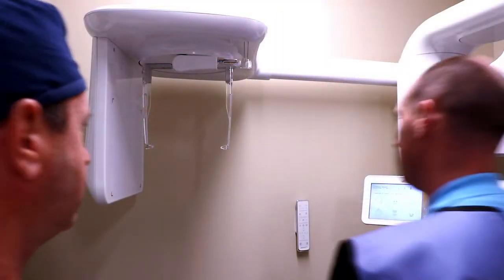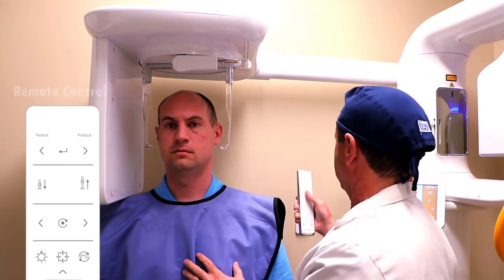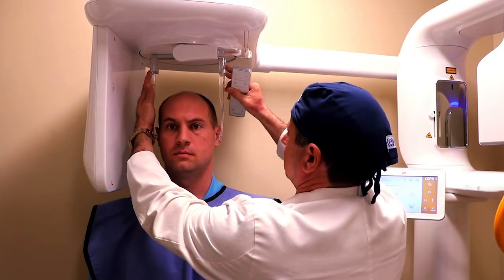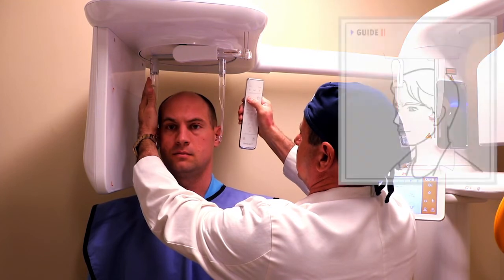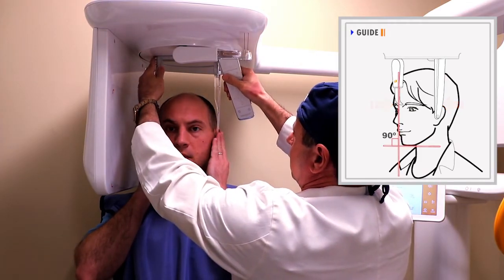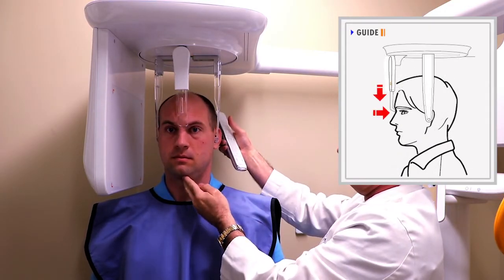Guide the patient to the Ray scan. Have the patient step into the self between the ear rods. Adjust the height of the Ray scan so the bottom of the ear rods are at approximately the same height as the patient's ears. Slide the ear rods so that the cones are gently touching the outer ear canal. Adjust the position up or down and slide it towards the patient.